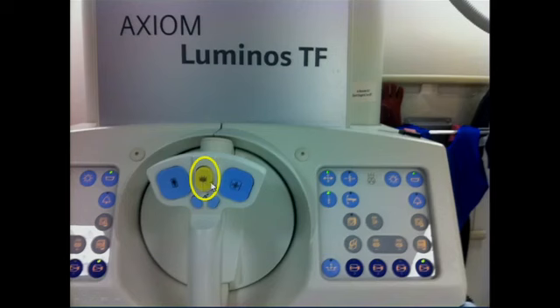This is our button for fluoro spots. And back in the II days, you know, we had to use that because basically when you hit that button, you were taking a picture of the output on the image intensifier. But we have much less need to do that now where we've got a last image hold, where the image that was currently obtained while you were fluoroing on your pulse fluoro mode stays up on the monitor, and you can just ask the tech to save that rather than taking an actual fluoro spot. That image was acquired with 1/10 the dose of taking a fluoro spot.